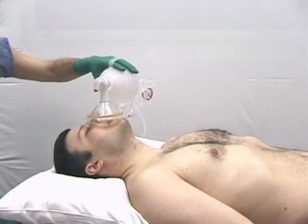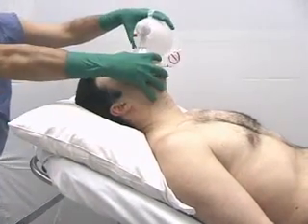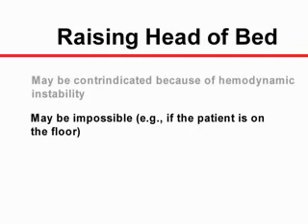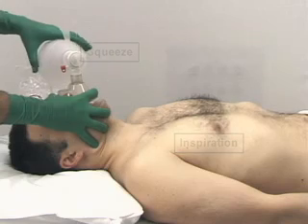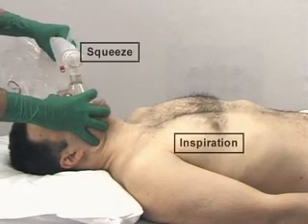Raising the head of the bed may facilitate the delivery of adequate tidal volumes, but may be contraindicated because of hemodynamic instability, or may be impossible, for example, if the patient is on the floor. When the patient is breathing spontaneously, one must synchronize the delivered tidal volume with the patient's inspiration.